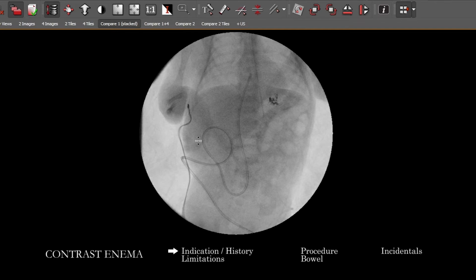A key thing as you're looking back into prior studies and also on your first preliminary look at the abdomen is if there's any concern for new or recent free air, periportal venous gas, pneumatosis, any sort of thing that can make you think that there's active bowel inflammation, or NEC, things like this, you want to reconsider actually performing the exam. Those sorts of things are what should be on your mind as you're leading up to actually performing the study.